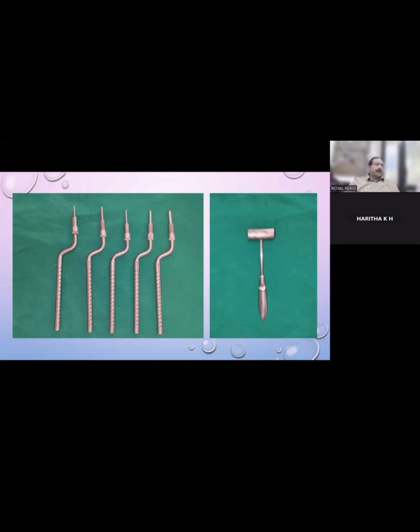So what you need to do is plan everything. Extract 5, H incision, confirm the crest, position and angulation with lance drill, then 6.5 with the stopper of the pilot drill, then 2.8, 6.5, 3 into 6.5.